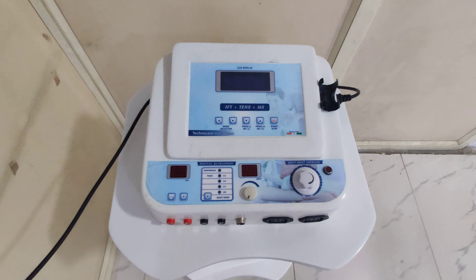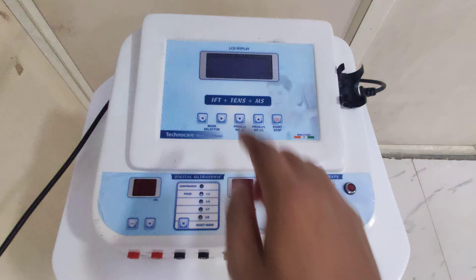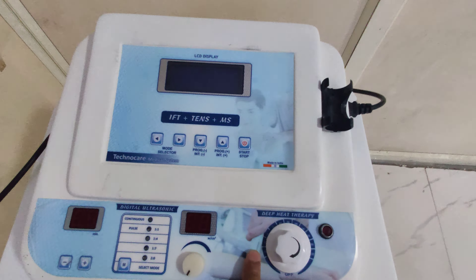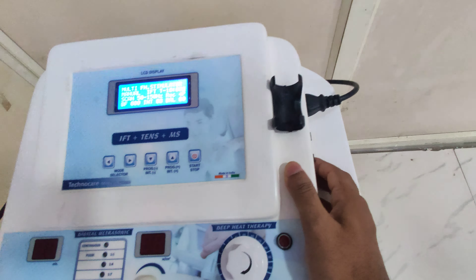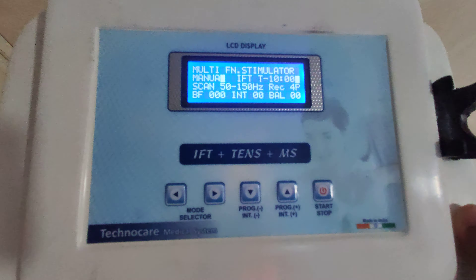Hi friends, today I'm going to tell you how to operate a 5-in-1 combination therapy machine. Here we get IFT, TENS, MS, ultrasonic, and LASER. First, switch on the machine. This one is for IFT, TENS, and MS, and this one is for ultrasonic. So first we'll go through IFT, TENS, and MS.